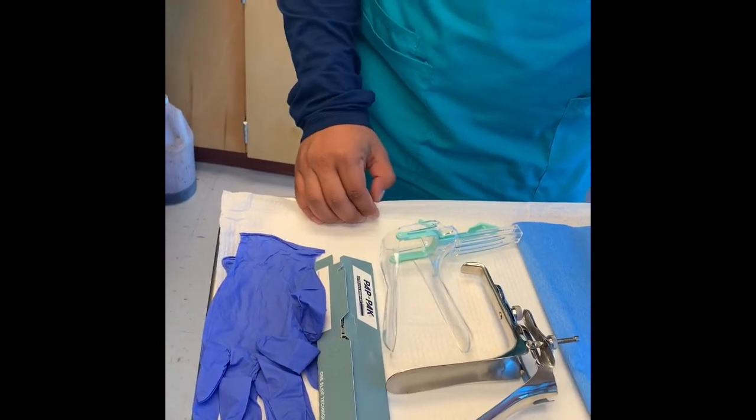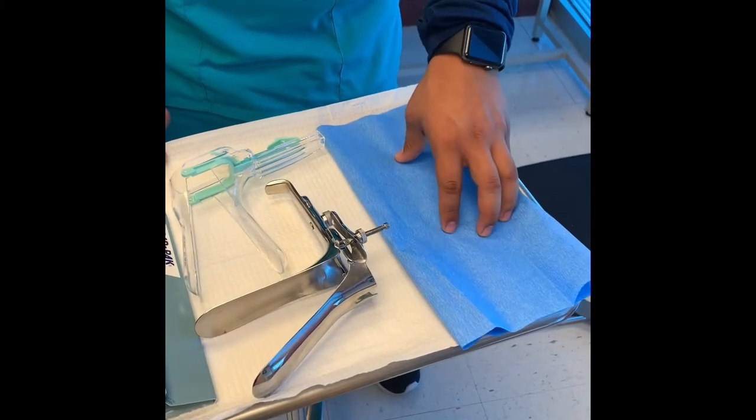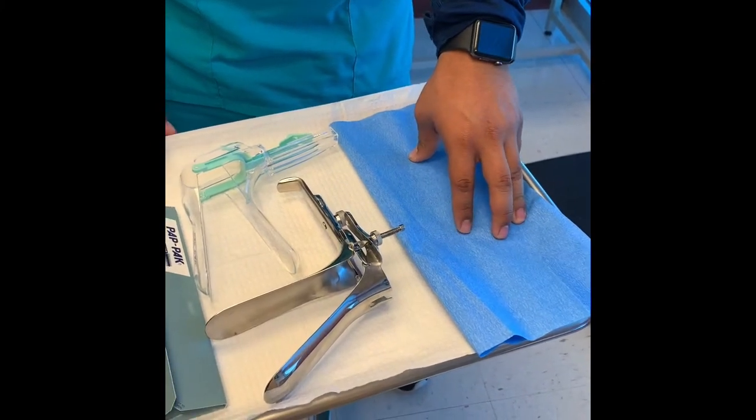We also need a drape. This drape is for you to change from your clothes to this one. It will make the doctor's or the physician's job easier.